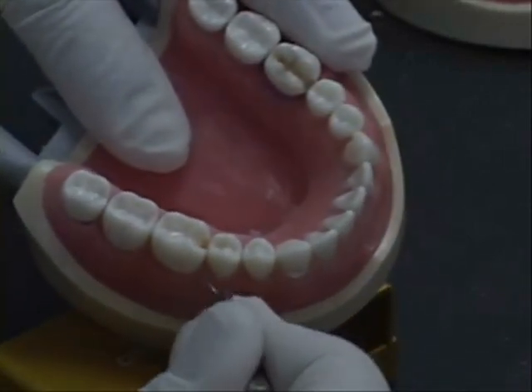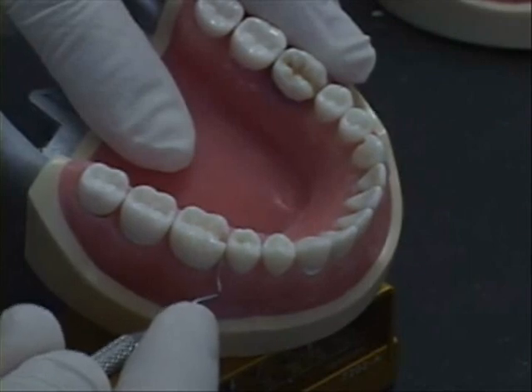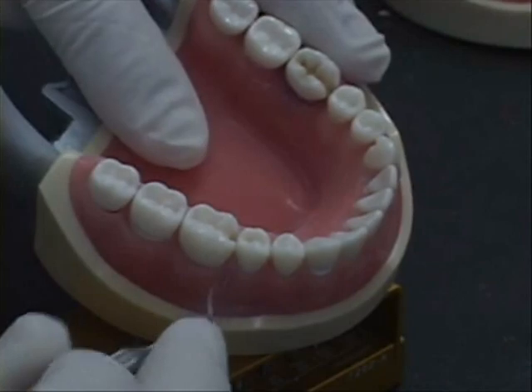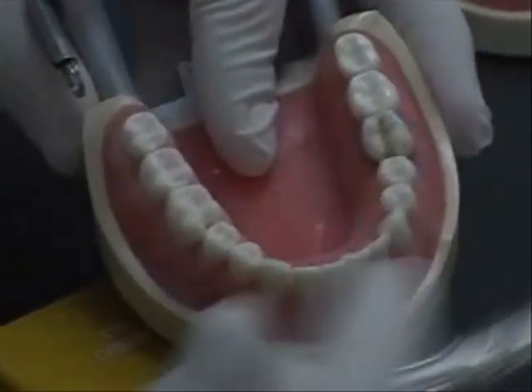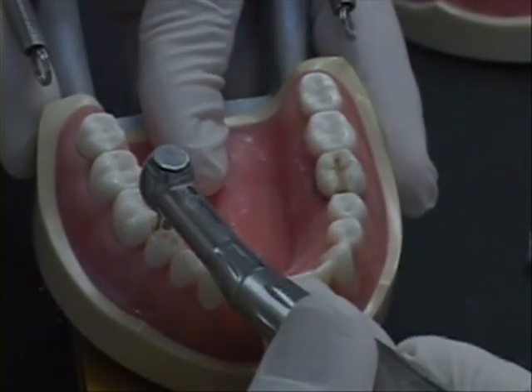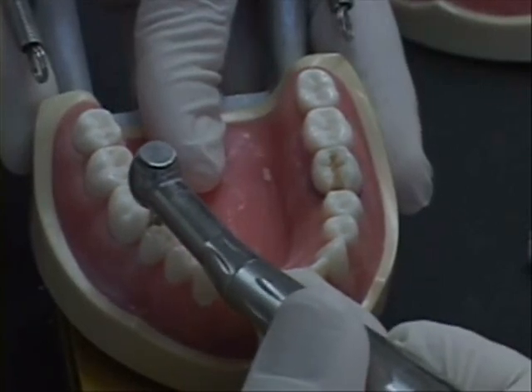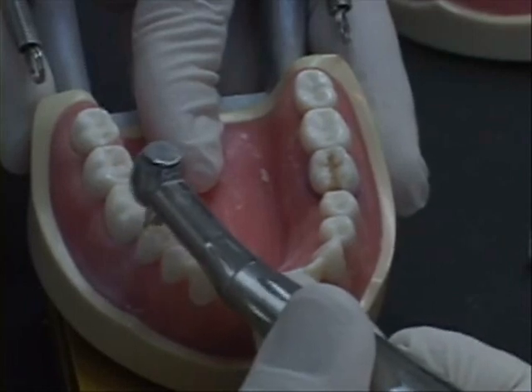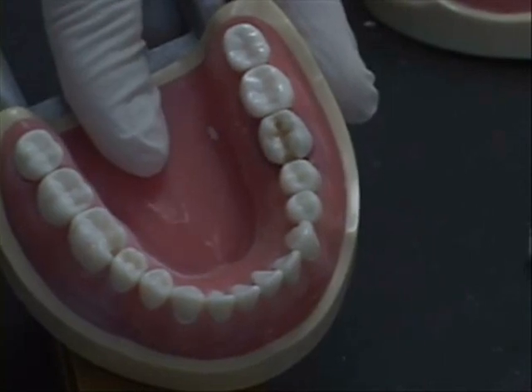I get my explorer tip. The tip cannot go through the gingival floor here. See? The tip can't go down quite enough. That means that I need to go down further in my gingival floor. So I gotta lower the gingival floor. Remember, the gingival floor has to be the first floor that's finished to ideal. So I go back in here. And now my gingival floor has the separation that I need.